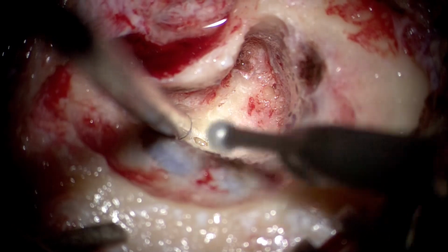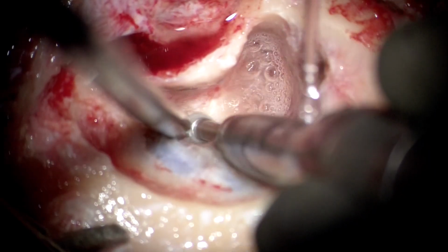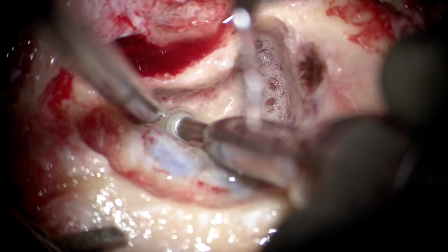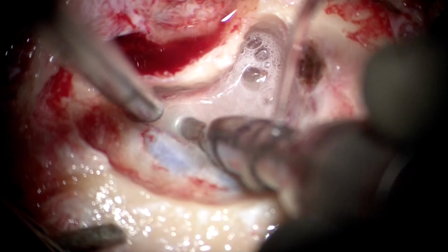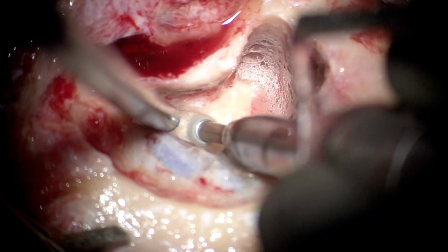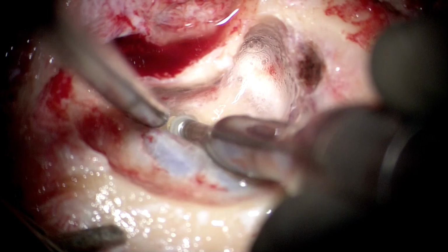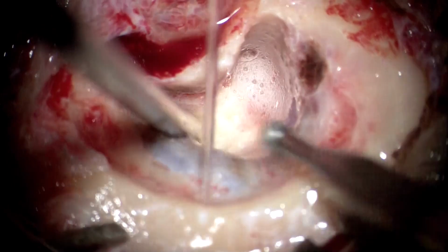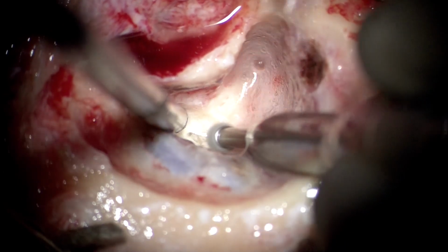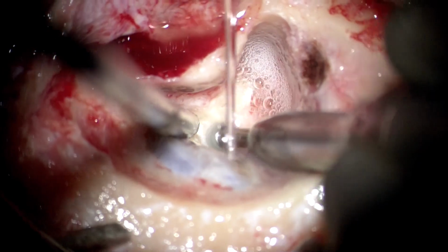So now one has in mind the partially opened lateral canal and the slightly and partially opened posterior canal. So we go on to expose some more bone behind these, to be able to expose the common crus, from where we could initiate drilling towards the superior canal. You see here how the posterior canal is now completely open. I mean the dome of the canal, not the ampulla and the non-ampullated ends.